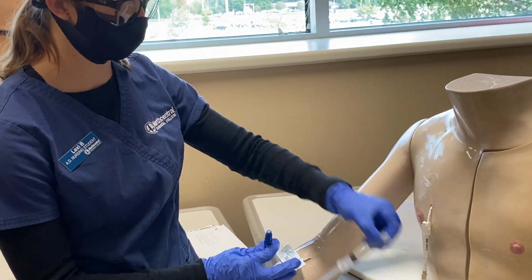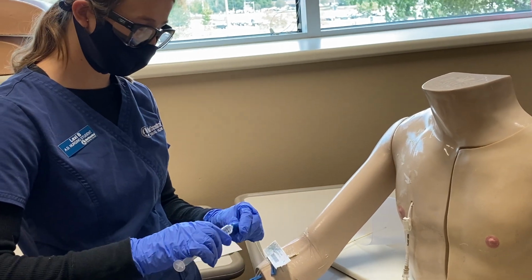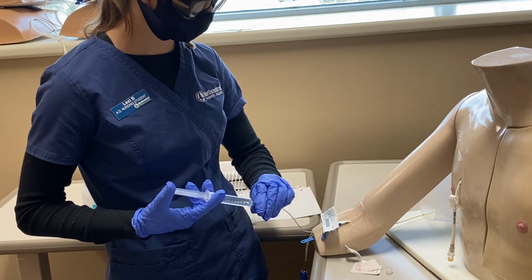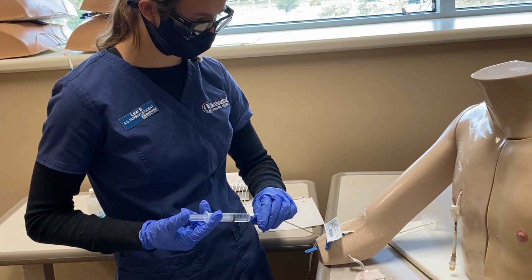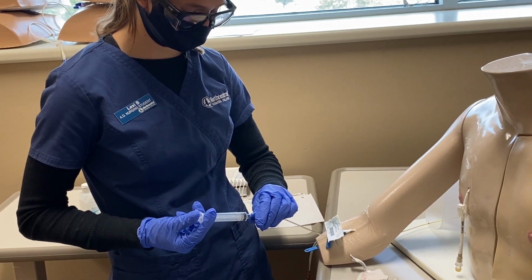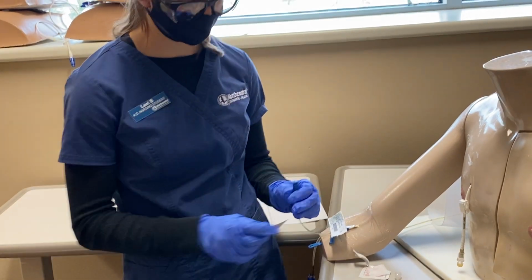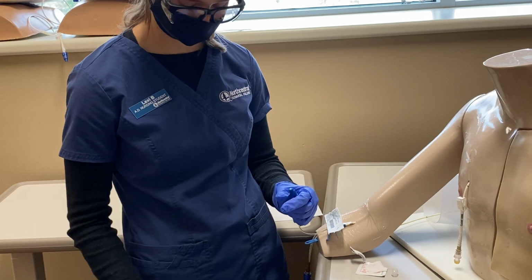Alrighty. I'm going to take my first normal saline and just make sure that the line is still working. Hello, my name is Lexi. I'm going to be your nurse today. I'm going to wash my hands. Alrighty. Tell me your name and date of birth. And then I'm going to get another alcohol wipe. 12/12/1999. Do you have any allergies, Bob?